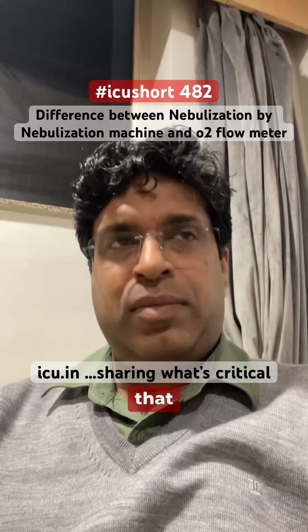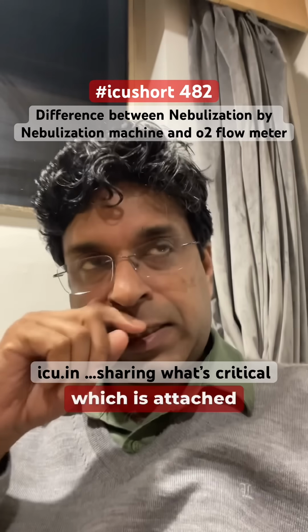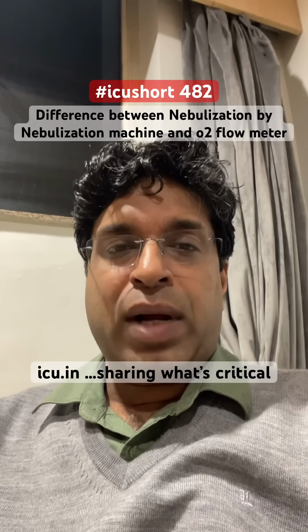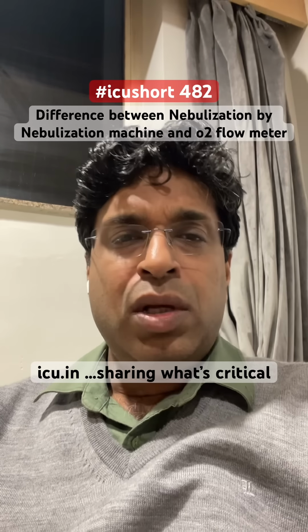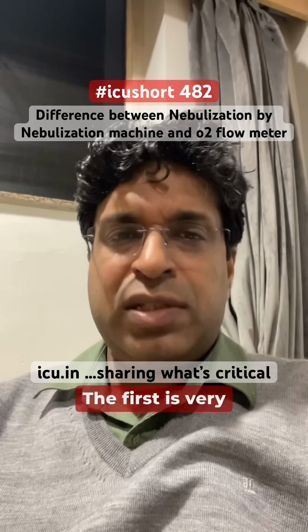So understand that both these ways, the nebulization machine and the O2 flow meter, which is attached at the patient bedside, are used to atomize the particles so that the nebulization fumes are formed. Now, the differences are mainly three or four. Let's see that. The first is very obvious.